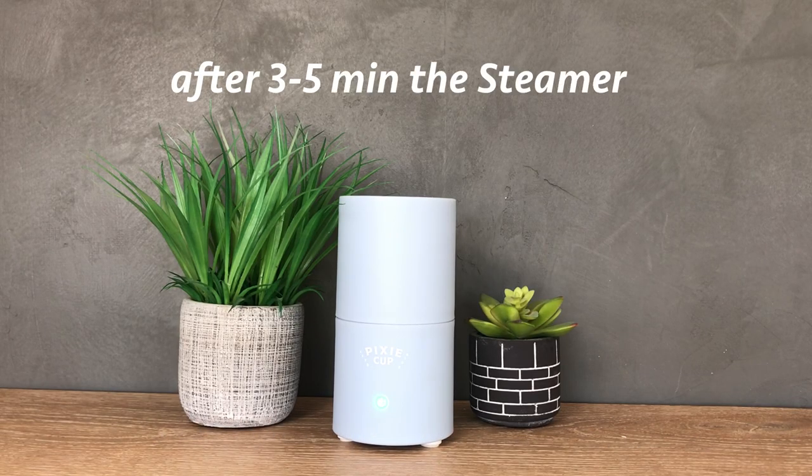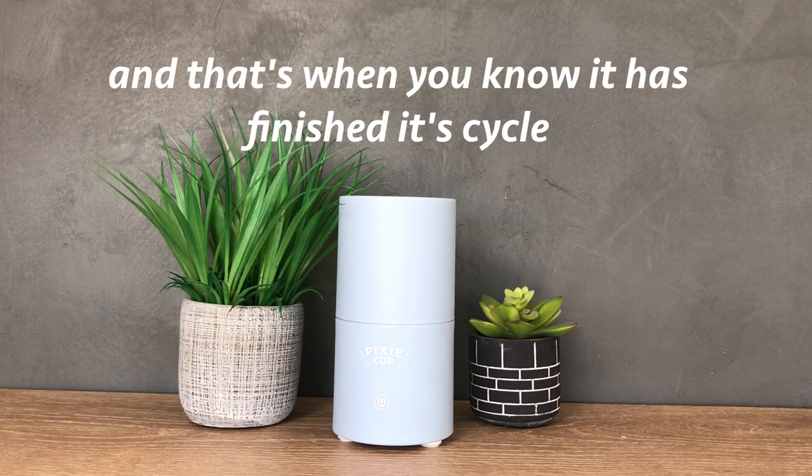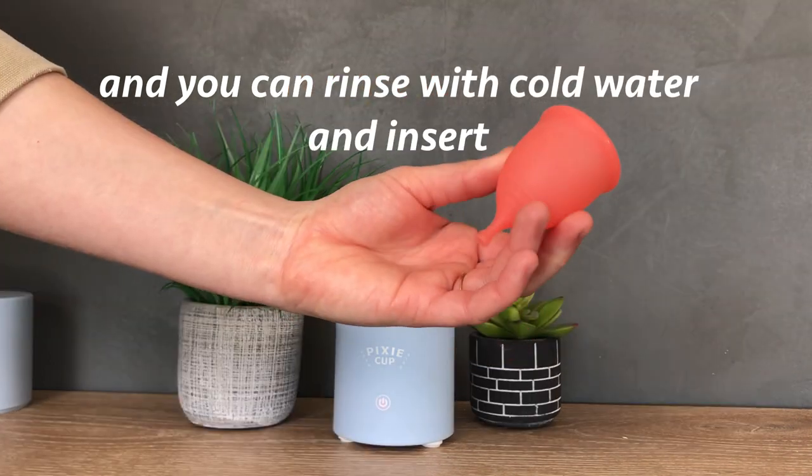After three to five minutes, the steamer light will go from green to red and that's when you know it has finished its cycle. Your cup is now sterilized and you can rinse with cold water and then insert.